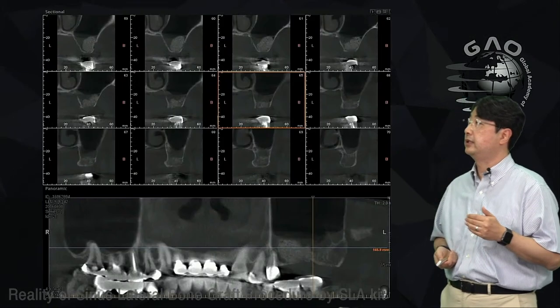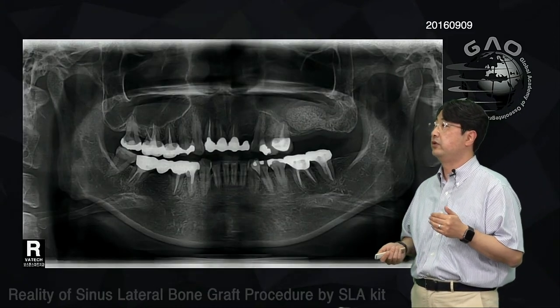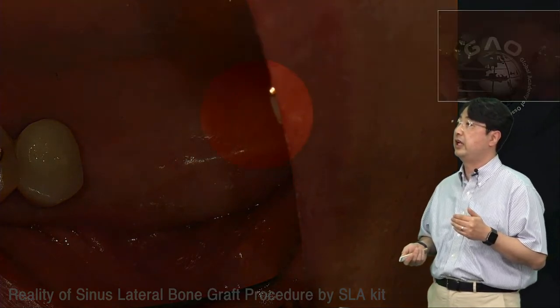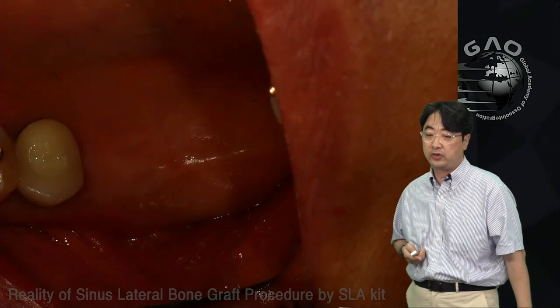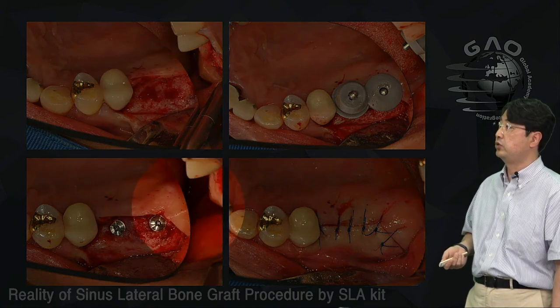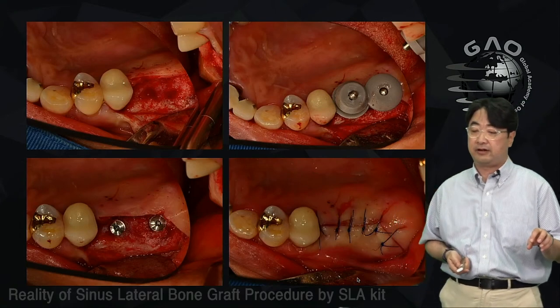So I waited a few months, and this is how it looked after a few months. Then this is the time of re-entry, right? As you see, there was no redness anymore. Then this is how it looked after wound opening for implant placement. And I placed two implants like this at the site where I did the graft.